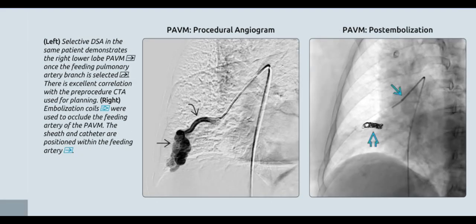Selective DSA in the same patient demonstrates the right lower lobe PAVM. Once the feeding pulmonary artery branch is selected, there is excellent correlation with the procedure CTA used for planning. Embolization coils were used to occlude the feeding artery of the PAVM. The sheath and catheter are positioned within the feeding artery.